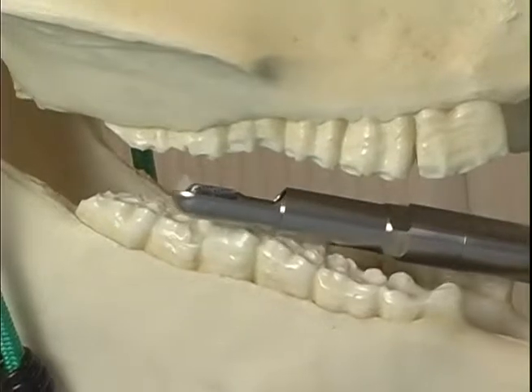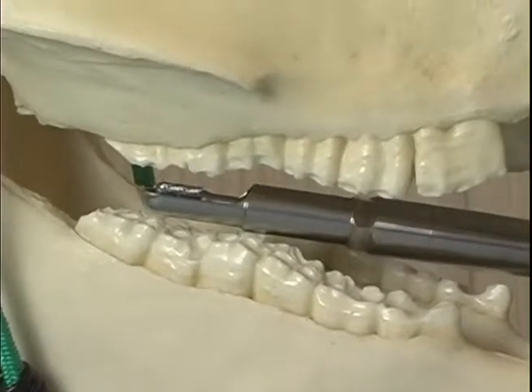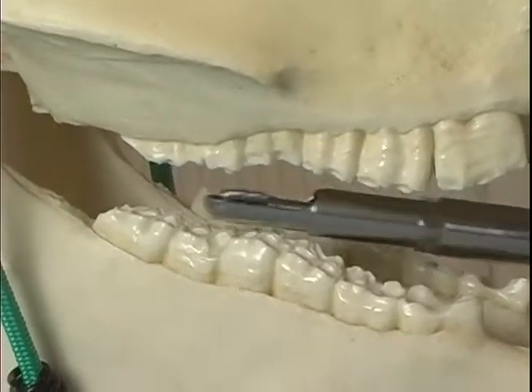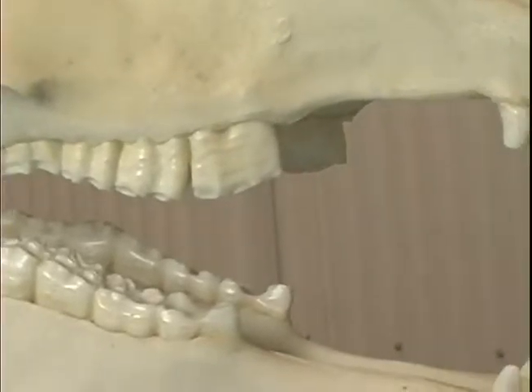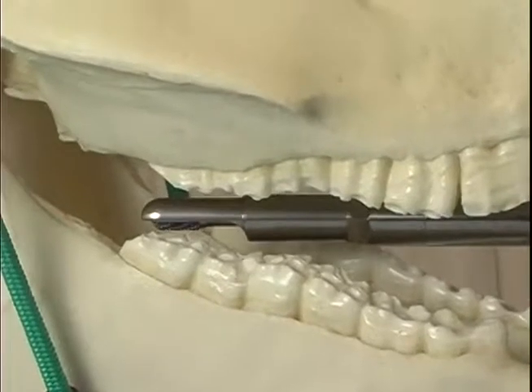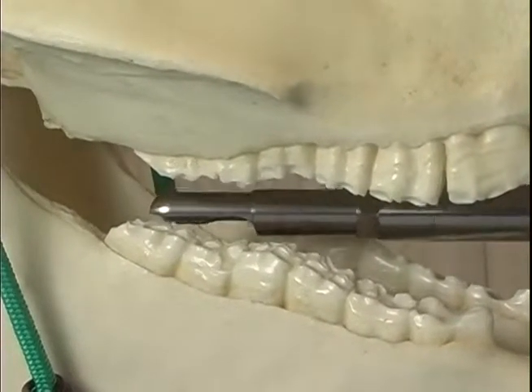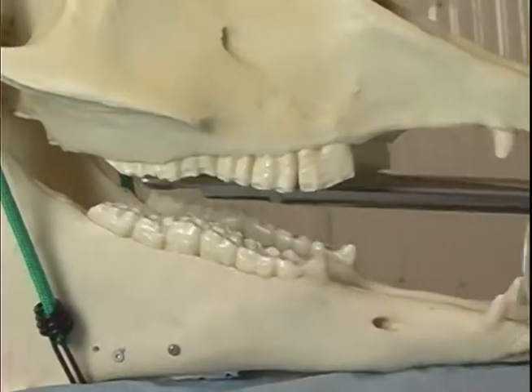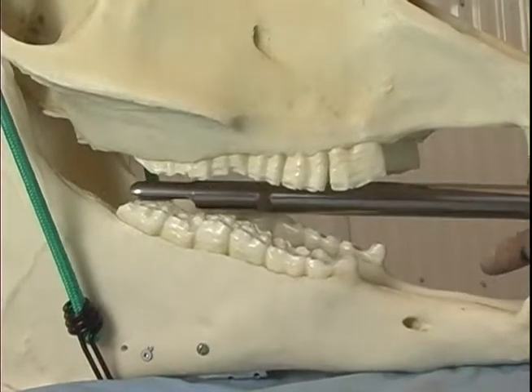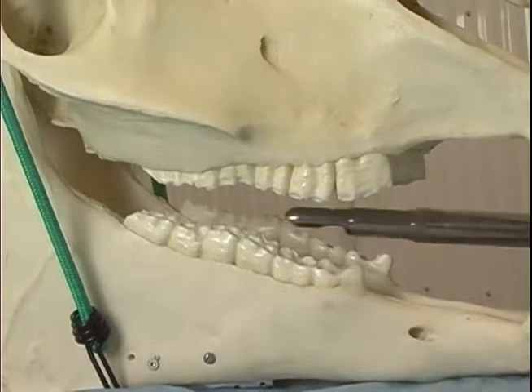The front can be done with the rest of the tool. This is only needed to get to the back. So you can float off the sharp enamel points, you can float off high spots, put it in the down position for the lowers. You still go across the mouth over the tongue. You can get access to the last hook, float it. You just have to steady it with your hand. This is how you access the back of the mouth in a miniature horse.